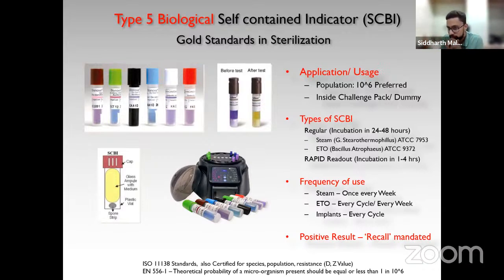And at 134, sir, what is the time? 134 is 3.5 minutes. That is the CDC guideline, sir. But again, at 3.5 minutes, it is very difficult for Indian conditions and Indian sterilizers to pass. That is why they take it from 134 to 5 minutes or 7 minutes.